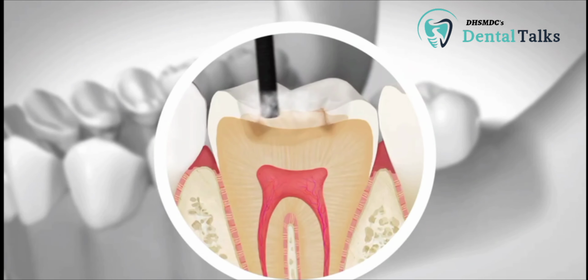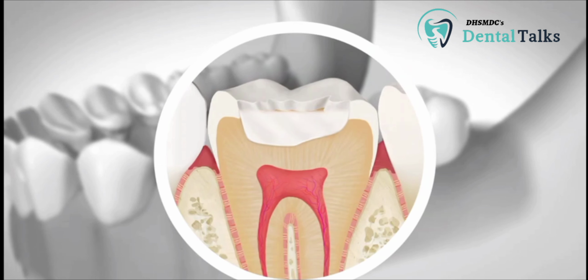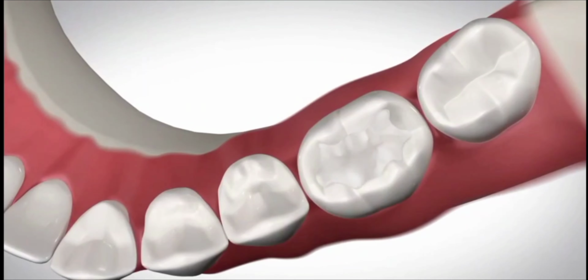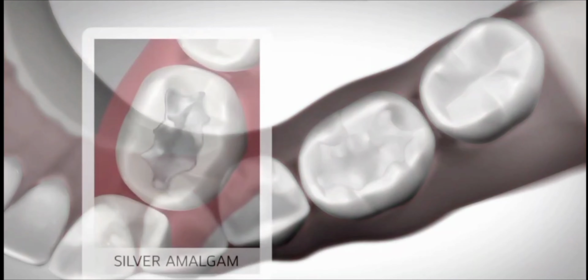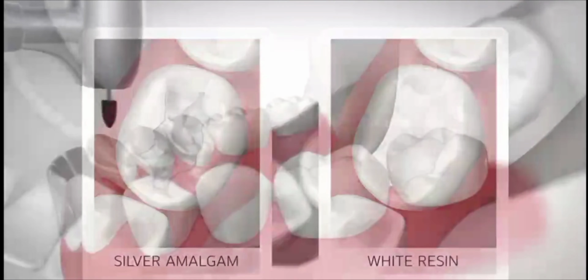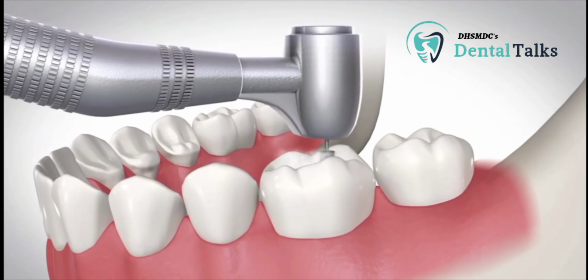The first step is to remove the decay from the tooth. Material is then placed in your tooth to fill the hole. Filling material can be made of a variety of materials such as silver amalgam or white resin. To complete your restoration, the filling is then smoothed so that it feels natural in your mouth.